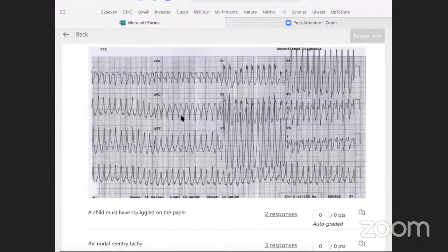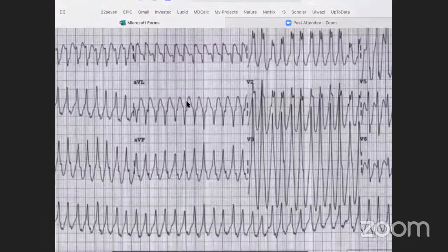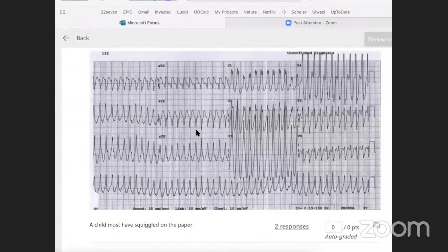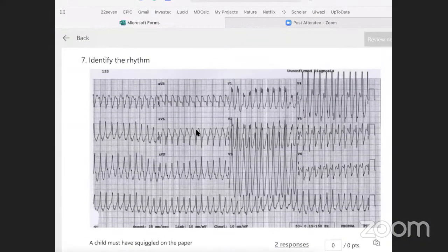And so if I thought that this was a supraventricular tachycardia because of the narrow complex, so here we can appreciate in AVL that this is the T wave repolarization, and then this would be a narrow complex. So in SVT, I give adenosine, then I would take out whatever beneficial function my patient has from the AV nodal blockade, and I would cause this patient to go into VFib.